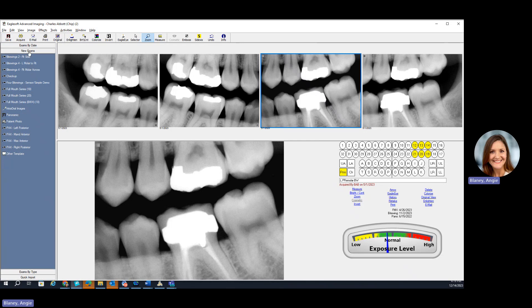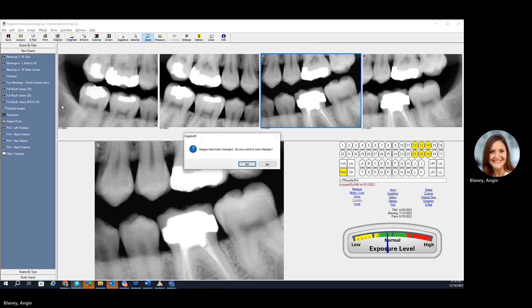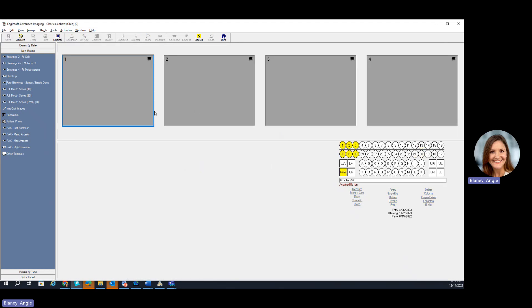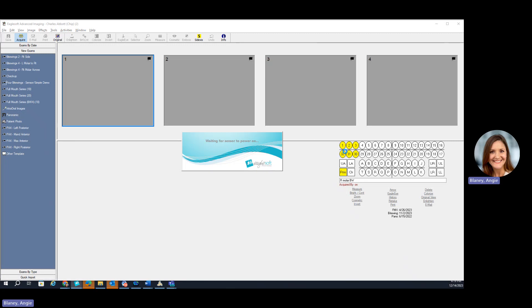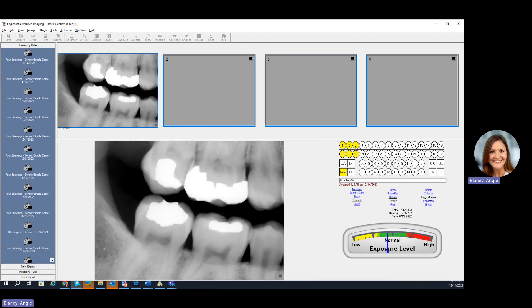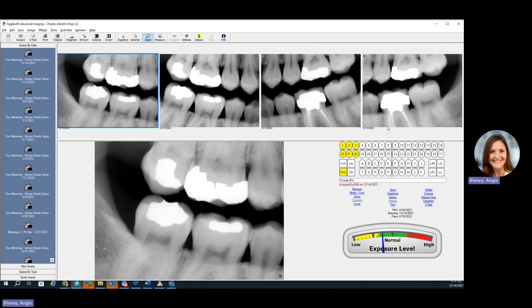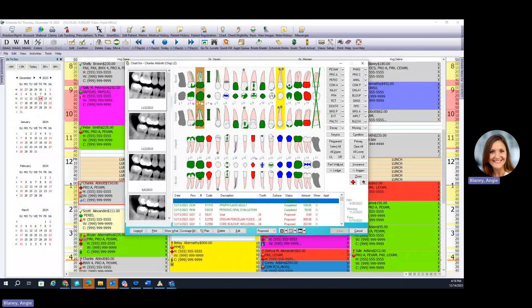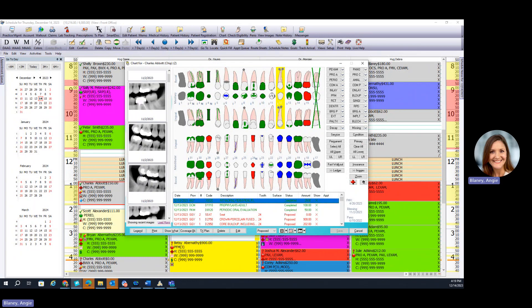To take a new exam, you would just click new exam and pick your template, then go ahead and capture your new images. What's also nice is you're able to link the templates — when you organize your templates, you can assign teeth numbers to the particular images, and then that will attach it to the chart. So when I come into the chart and click on tooth number three, any of those images that contain that tooth number will reflect here.